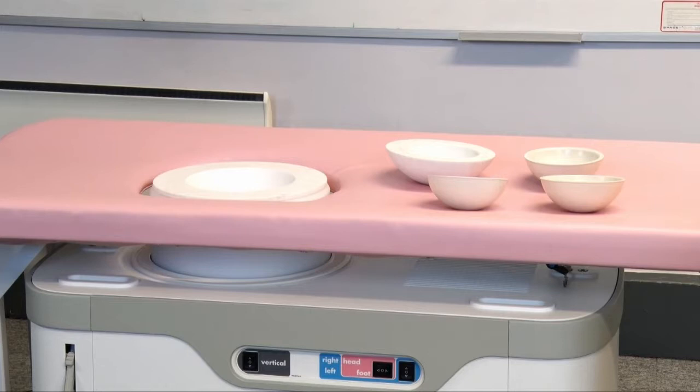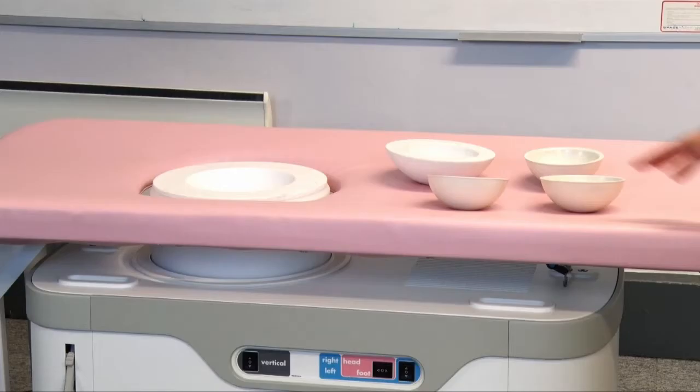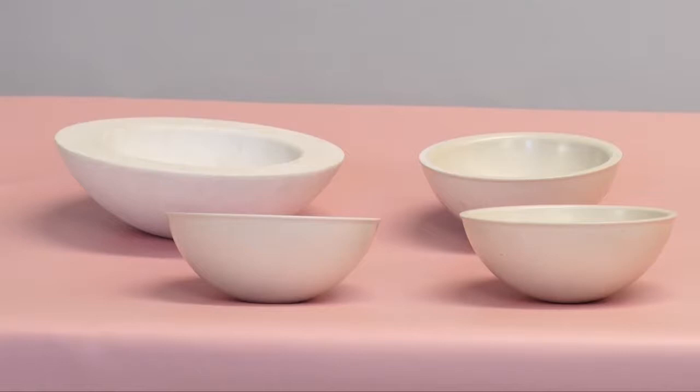The system comprises of a patient bed, padded for patient comfort, with an aperture to allow the array to come up to meet the patient. This is the main coupling shell, and then we have various sizes of insert to cope with different sizes of patient.